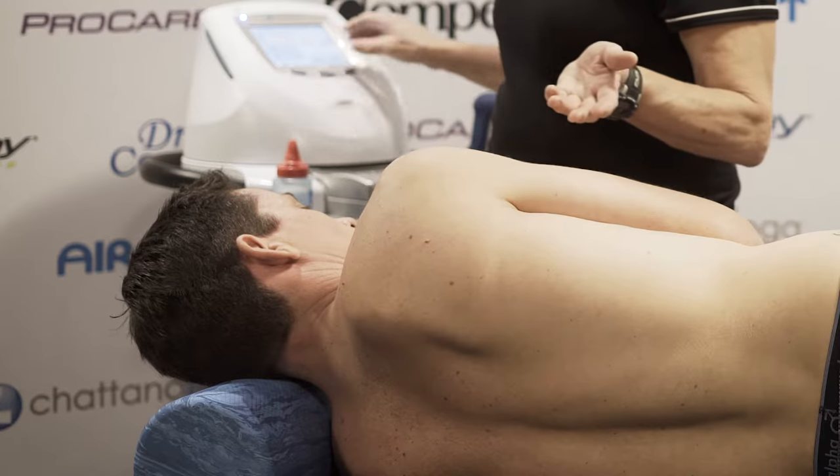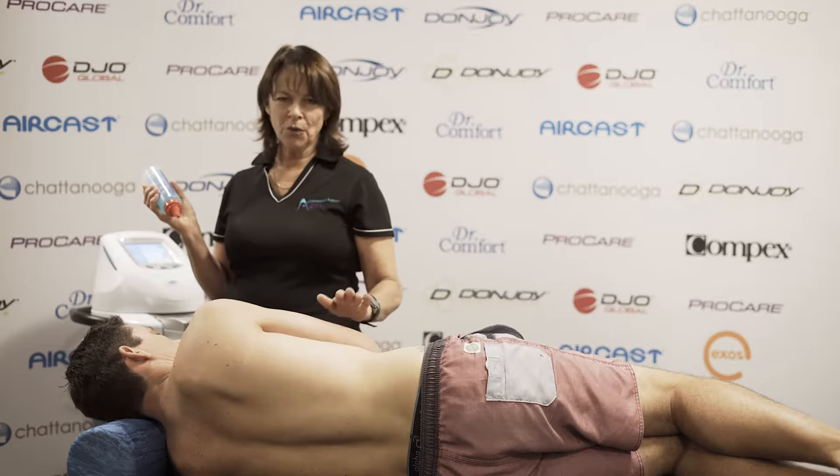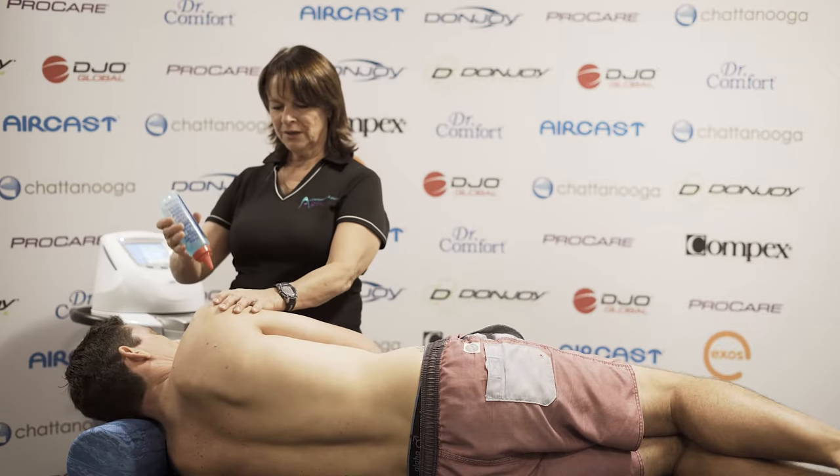One of the conditions that this is very effective for is tendinopathy in the shoulder, and probably the most common tendon damaged in the shoulder is supraspinatus, which is through the front of the shoulder here.